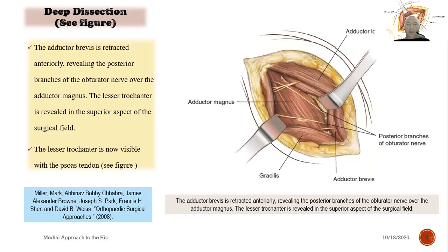With the psoas tendon now exposed, I can identify the structures: this is the adductor longus, this is the gracilis. You can see the adductor magnus and the posterior branches of the obturator nerve, and on this side, the adductor brevis.